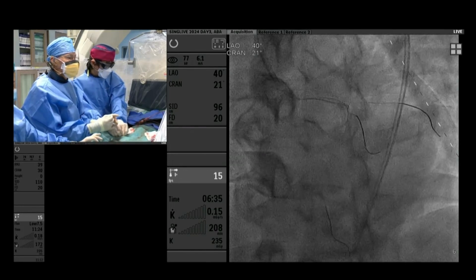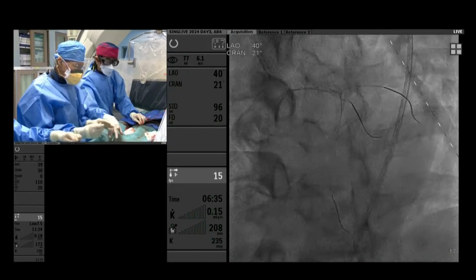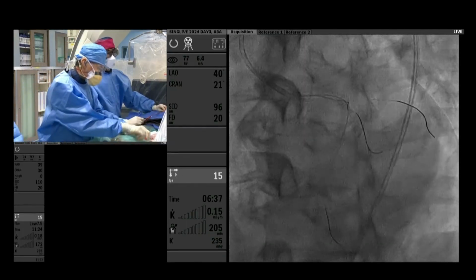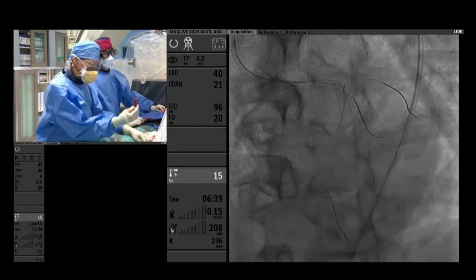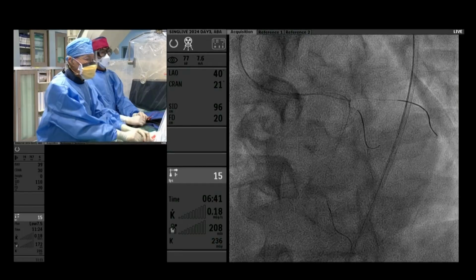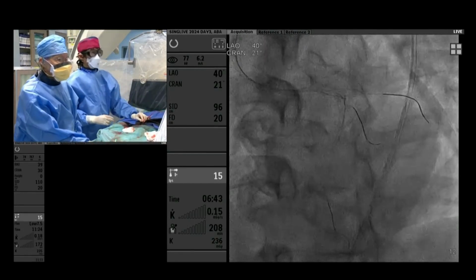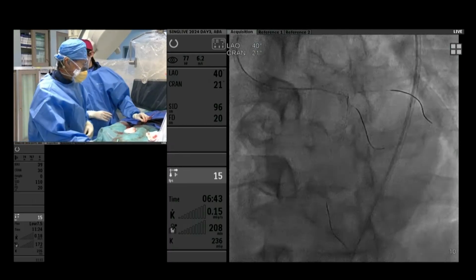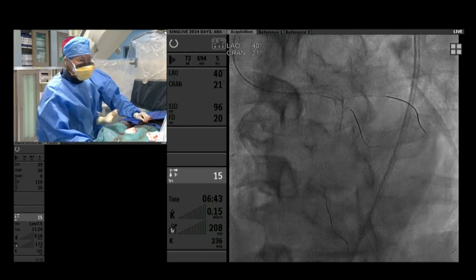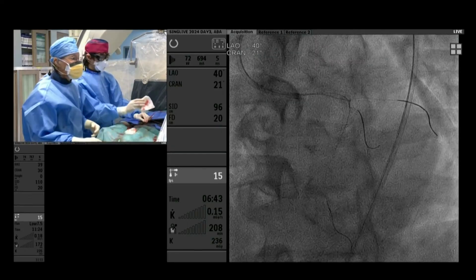So how much contrast did you use so far? 2 puffs I saw, is it 3? We took 2 shots. Yeah. I think we only use a 5 cc syringe, so maybe like 1.5 puffs. And then I think very important is that at the end of the injection, you should try to remove the remaining contrast in the guide, which can be quite substantial, which I have done. But while we are removing it, you've got to be very careful that you don't suck air in because you've got multiple wires, multiple balloons inside. So that's the current situation.